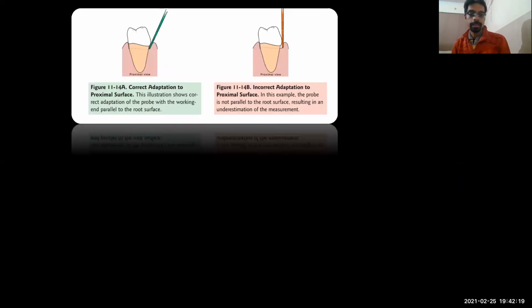Now, what is the correct adaptation of the probe? Probe should slide onto the surface of the tooth. It should not be parallel to the long axis of the tooth. It should slide onto the surface of the tooth so that it can move according to the surface.